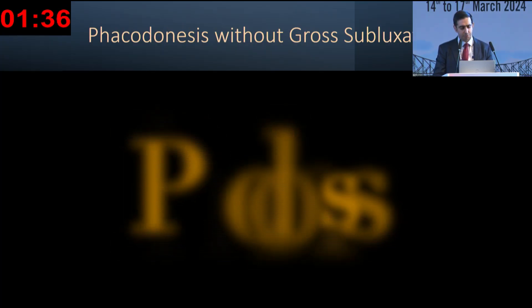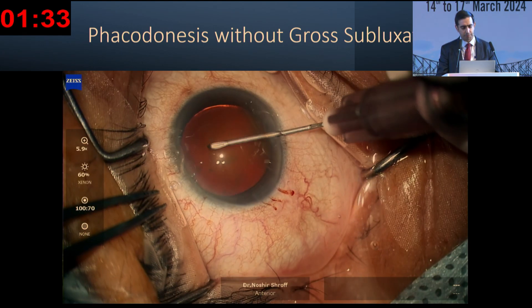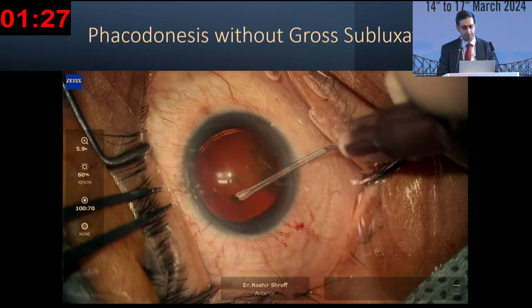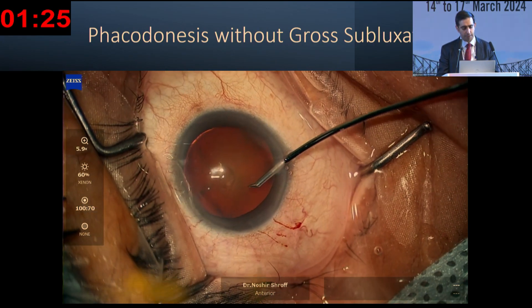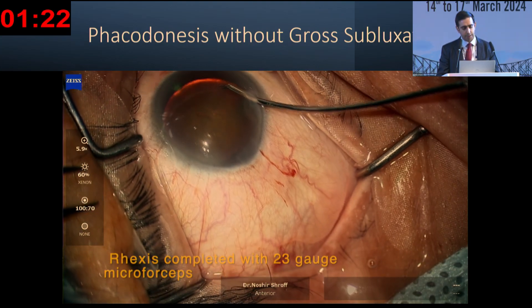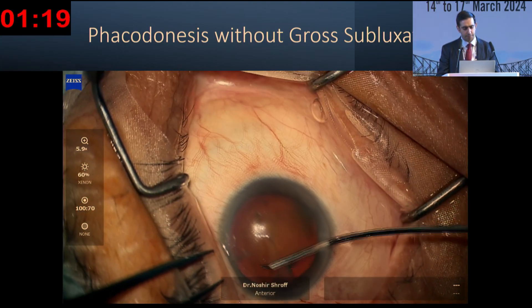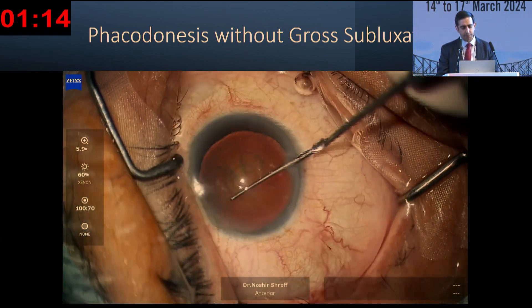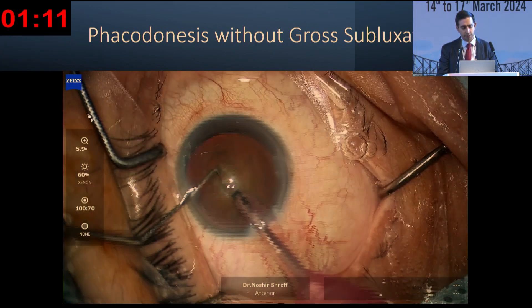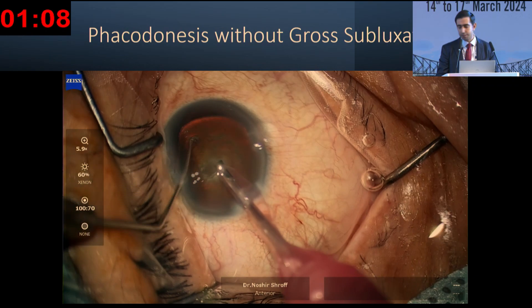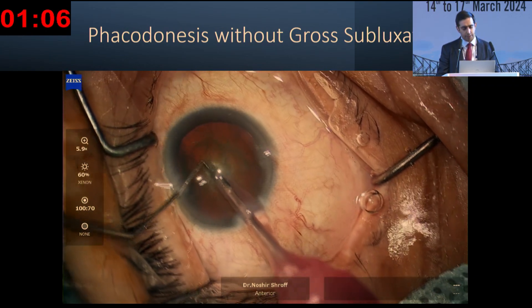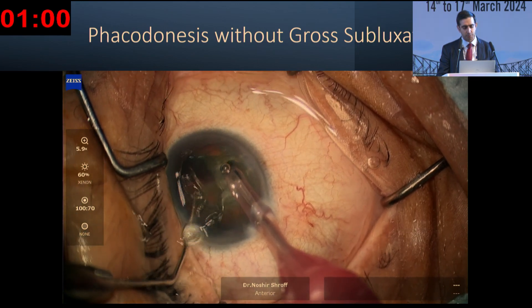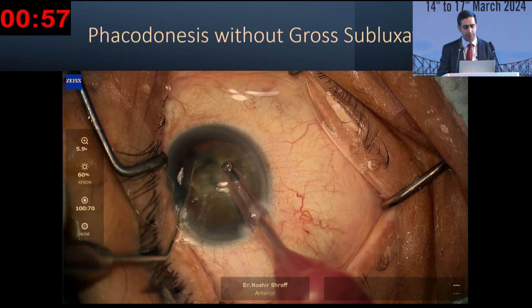The last case is FACO with zonular dialysis and subluxation — about five to six clock hours. Difficulty in initiating the rhexis points out this abnormality. Once entry is made, we use the micro-rhexis forcep. It's important to try and make as large a rhexis as possible. The good thing in this case was that after hydrodissection, rotation was actually quite easy, so we could go ahead. For phacoemulsification, it's important to lower the parameters.